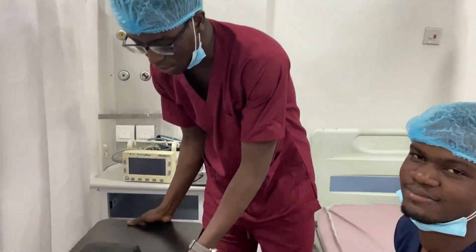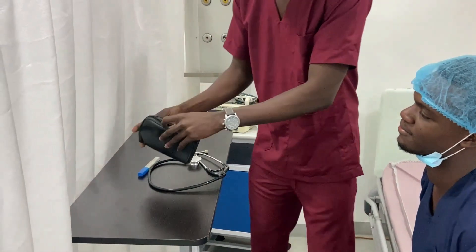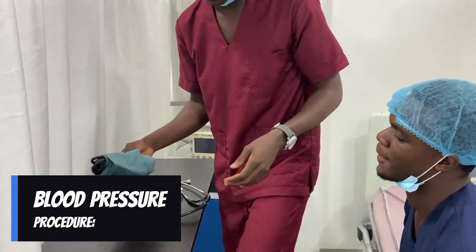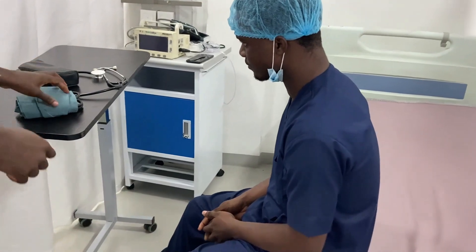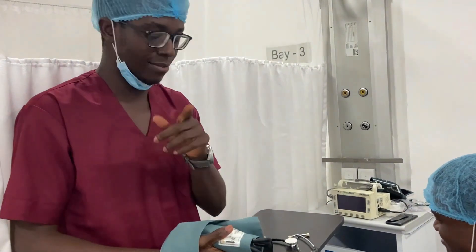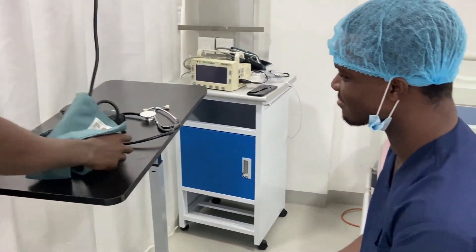Now you'll take the blood pressure. You go to your patient's left side. Why? Because the heart is on the left side of the body — anatomy and physiology, make sure you read it.